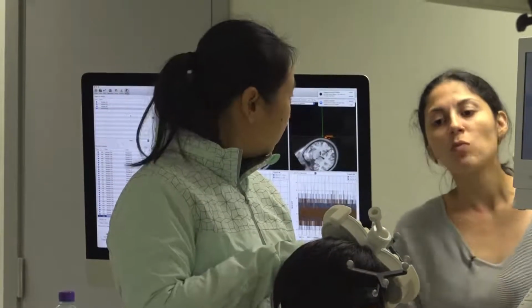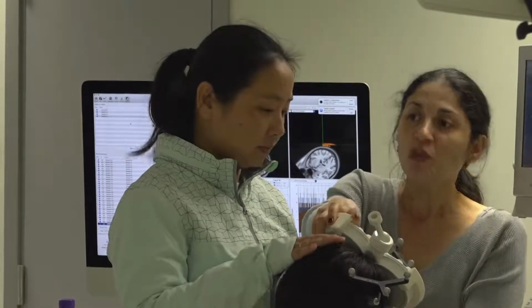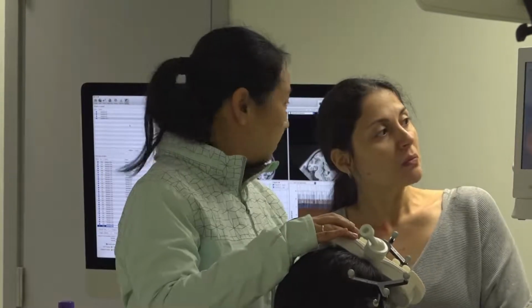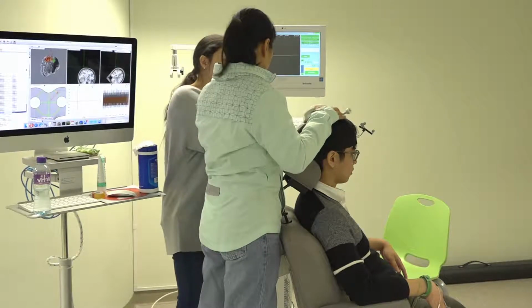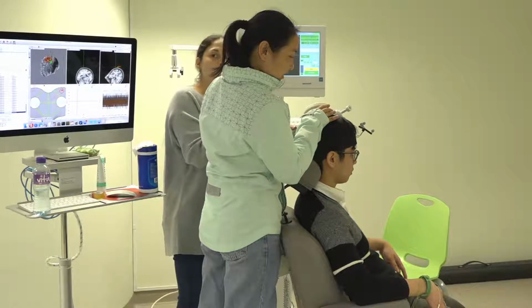So you mean I can? You can click, yeah. Can you see that it's not? Exactly. You want to see the finger first. I gave you a bad example. The first thing you want to see is that you can move the finger.